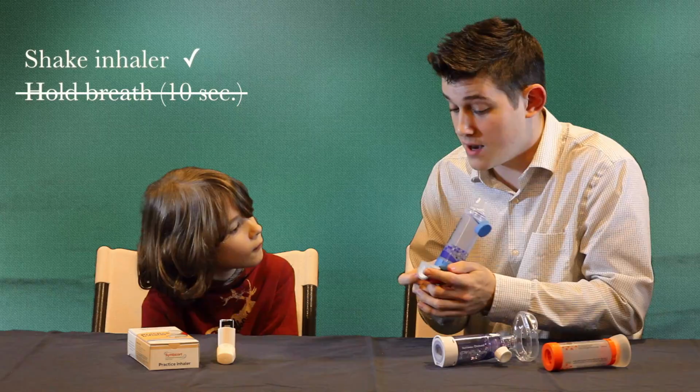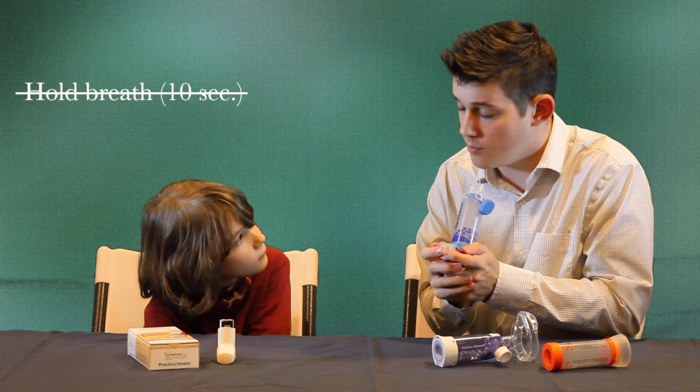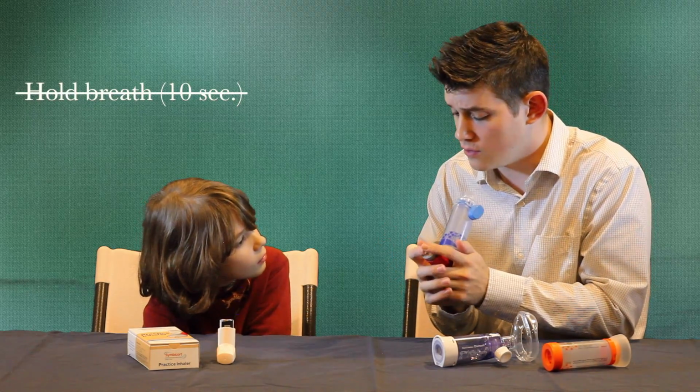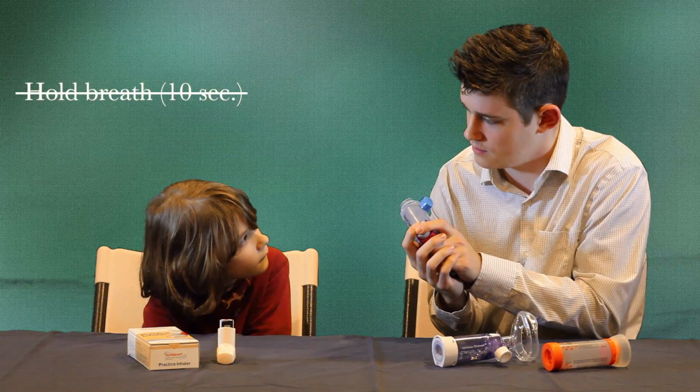And then after that, I thought you did a really good job breathing all the way out and timing the breath with pressing the inhaler. But I noticed you had a little trouble, and that's okay because it's really hard to push these down. So try to practice that two-handed method so you can get both fingers to press down, okay?